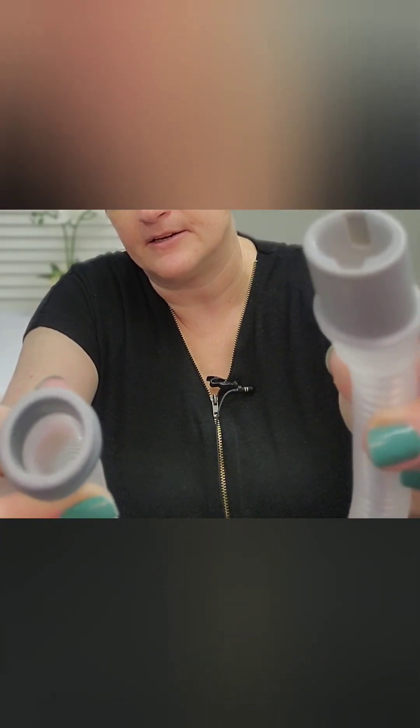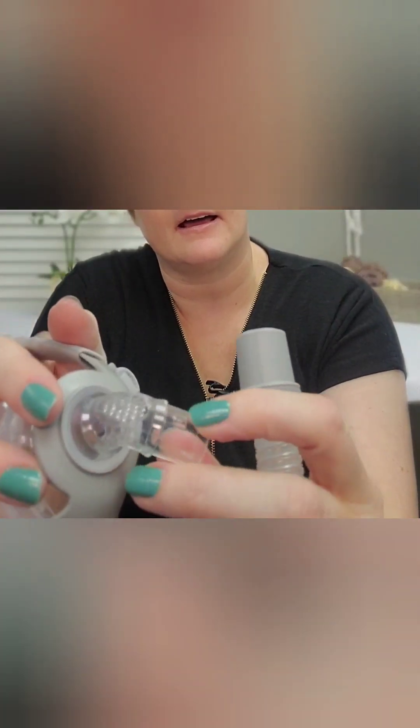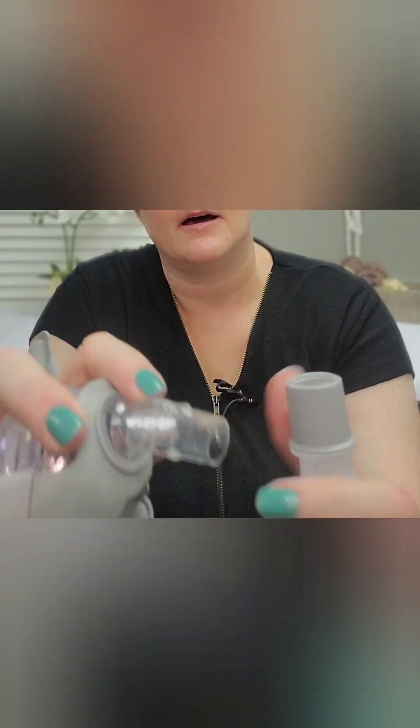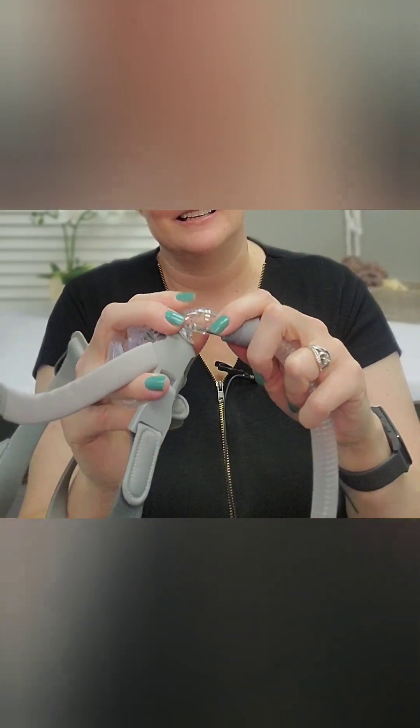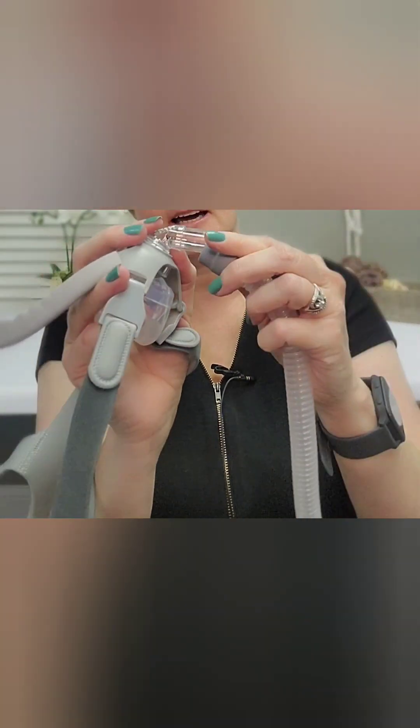Right away I noticed that the ends of these tubes are not the same — they don't even look the same. This one has a kind of divot coming out of it. The squishy, collapsible side goes on the mask, and this must be the disconnect. The one that doesn't disconnect swivels and goes on your tube. These are very similar in size, which is unusual — just go by squishiness to tell them apart.